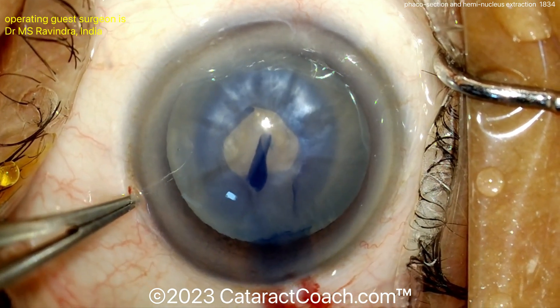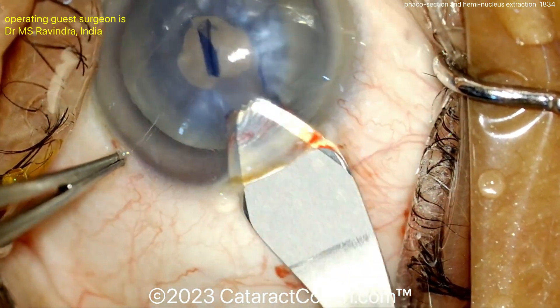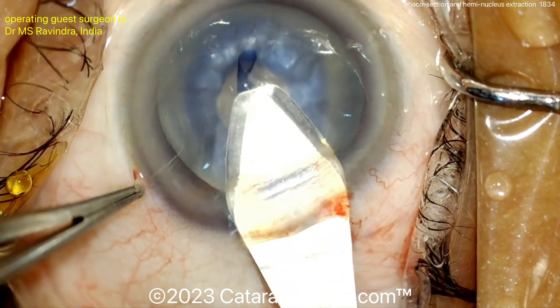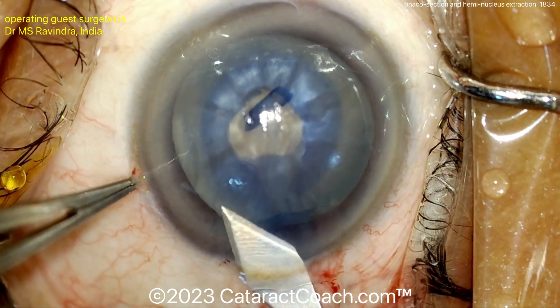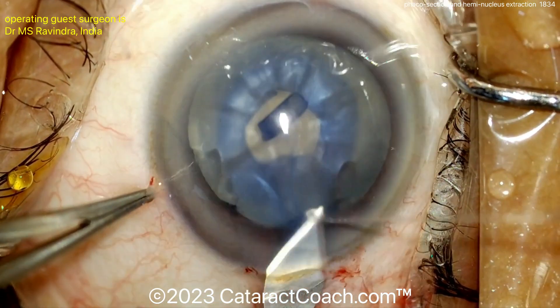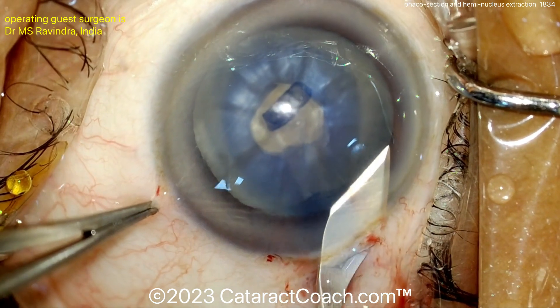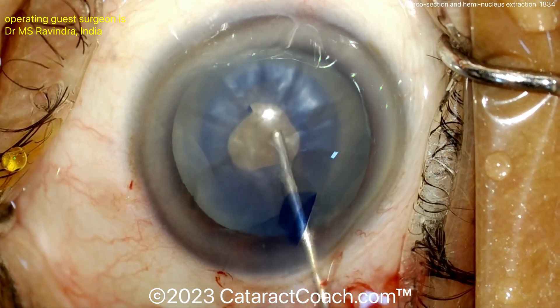Remember, this rexis — the small initial rexis — does not have to be any specific size or even shape. You can see here decompressing, tilt that nucleus a little bit, maybe go in there and wash out a bit. Now here's enlarging the incision — looks like maybe making it about four, four and a half millimeters — so a pretty large incision here, enlarging just a pinch more. Probably about a four and a half millimeter incision.